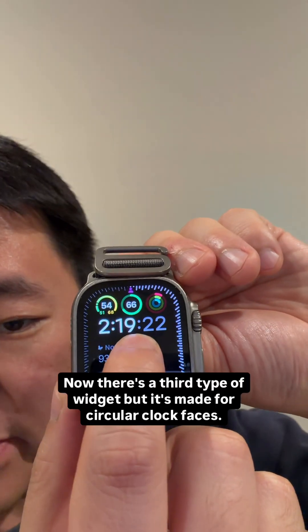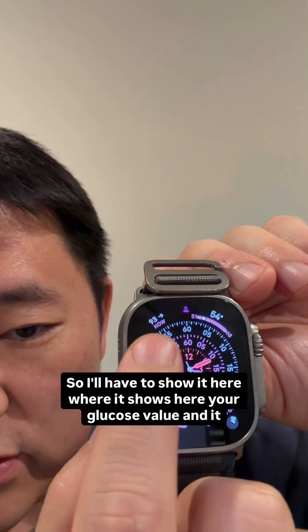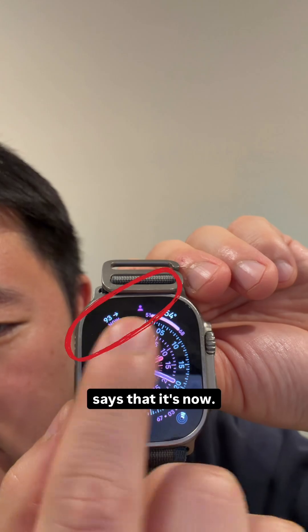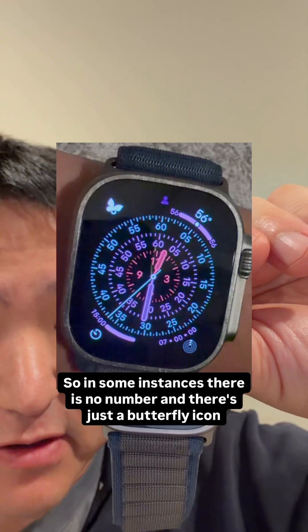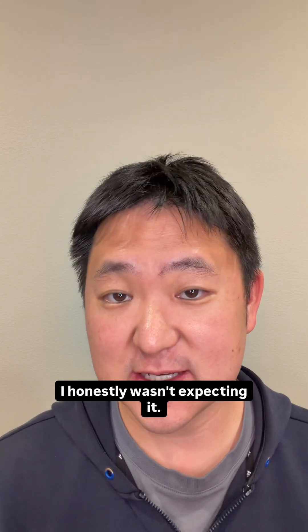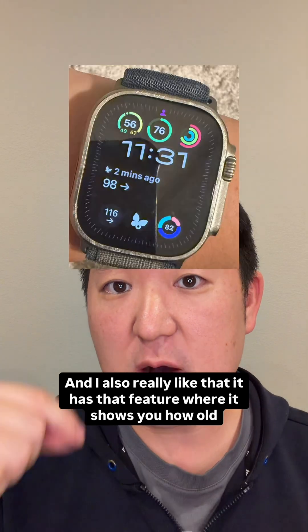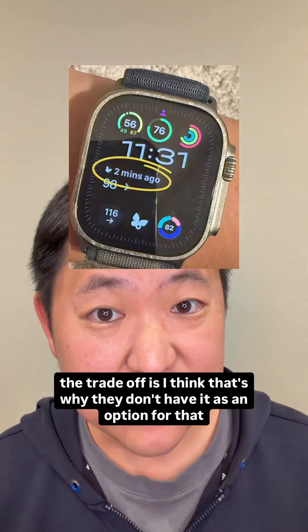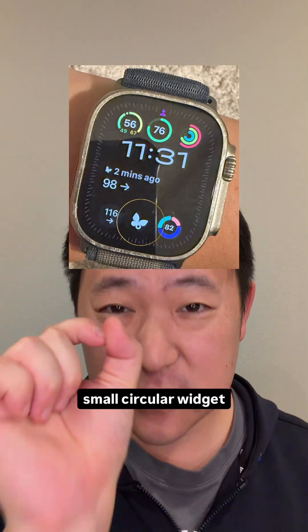There's a third type of widget made for circular clock faces, where it shows your glucose value and indicates that it's current. I will say it's not always updated — in some instances, there's no number and just a butterfly icon. Overall, I love that there's an Apple Watch widget; I honestly wasn't expecting it. I also really like that it shows you how old the glucose value is.